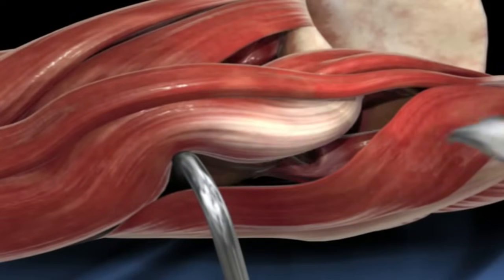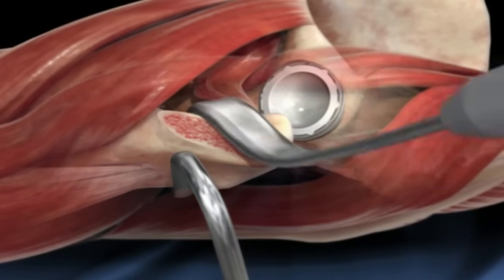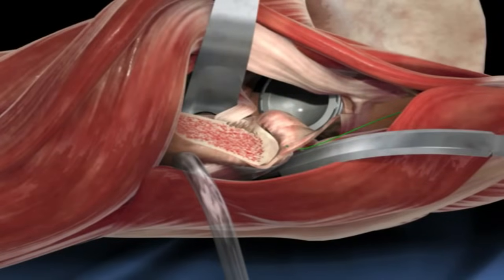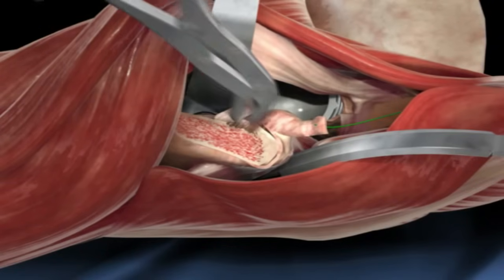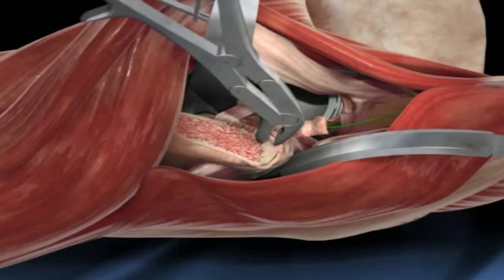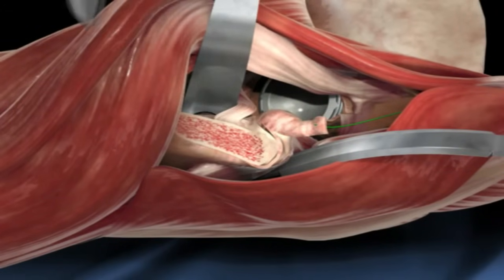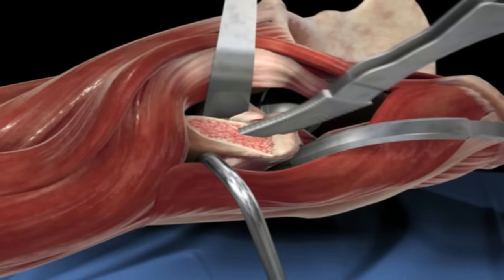Here the retractors are placed around the femur giving exposure to the canal. The hip capsule is further released and this tool is used to remove any excess bone.